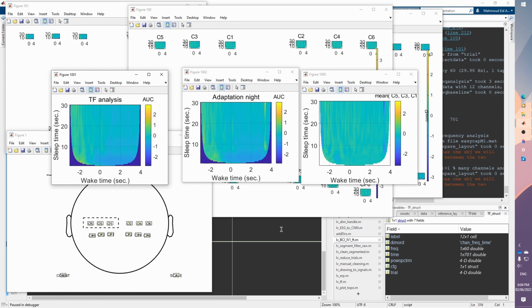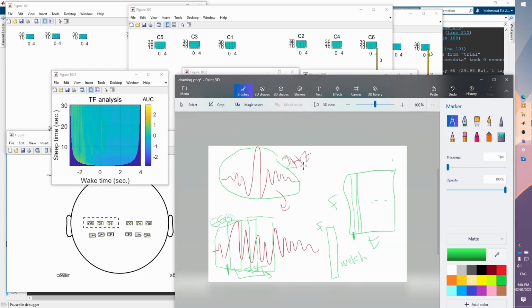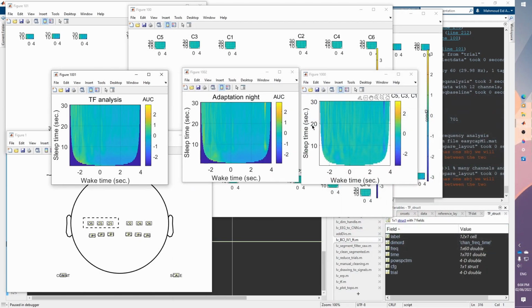So what will happen if you are trying to estimate 1 Hertz? If you are trying to estimate 1 Hertz and you specified that you need 5 cycles, so you need 5 seconds, but your actual data doesn't have 5 seconds. It has a duration lower than that, then this would be a time point that you cannot estimate, basically. That's why you would see these edges that cannot be estimated, so they have none values.